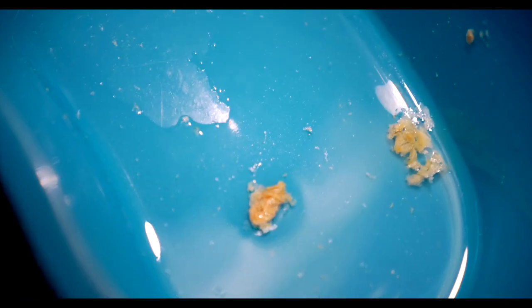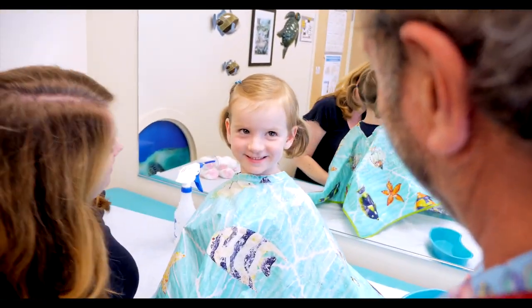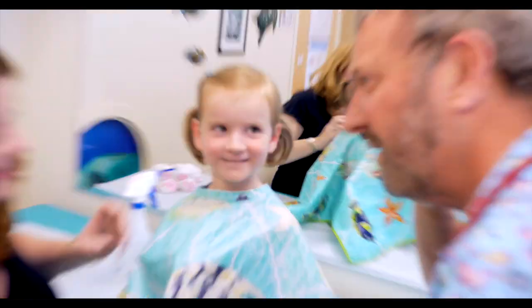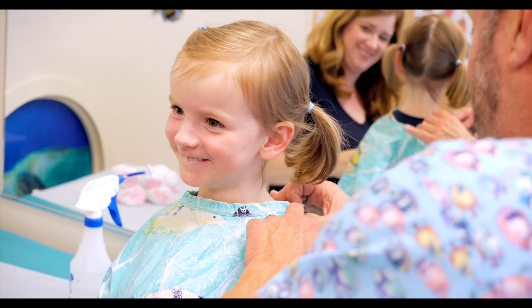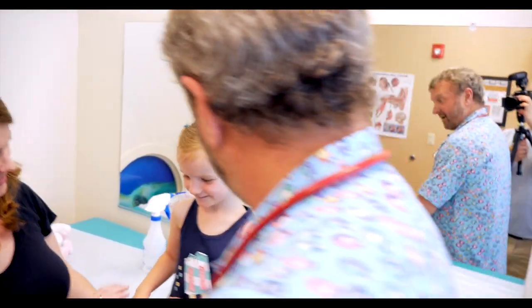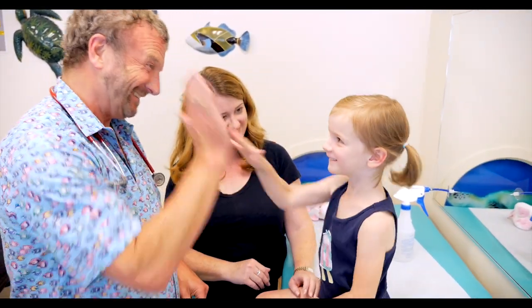You want to see it? No. You have the cleanest ears in town now. Do they feel much better? You can hear? Yeah. What did you say, Mom? I want to tell you — you were the best patient ever. Absolutely ever. Best patient. High five! Yes.